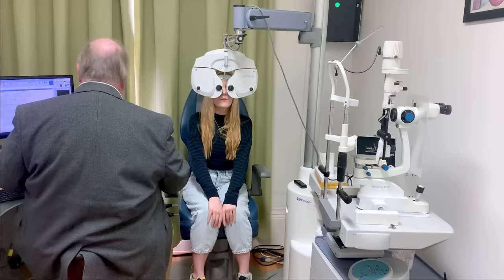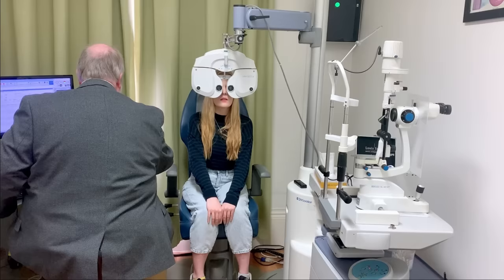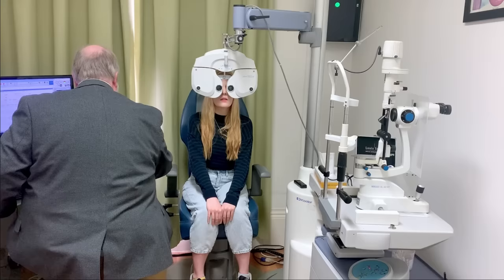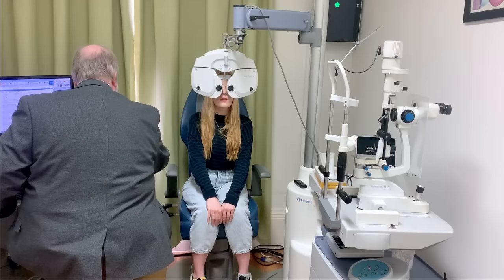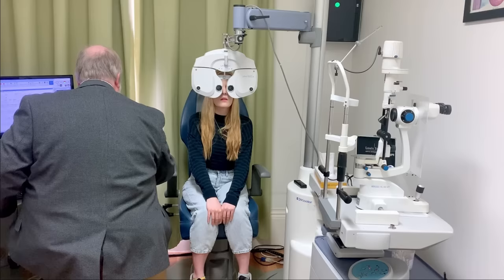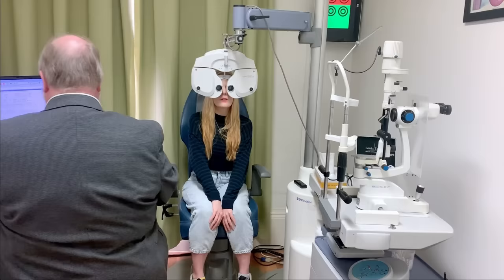So I'm going to blur things a little bit more for you now, okay? Okay. It'll get a bit blurry, okay? Okay. So. And that should have blurred both nicely for you. Okay. Can you see my green colour there out in the distance? Yeah, it's like a traffic light, like red and green, yeah. That's a bit artsy though, isn't it?